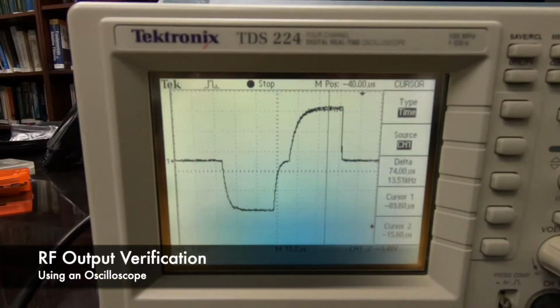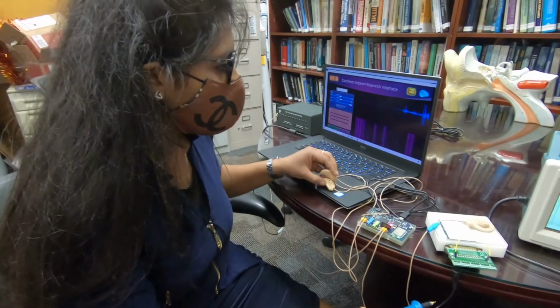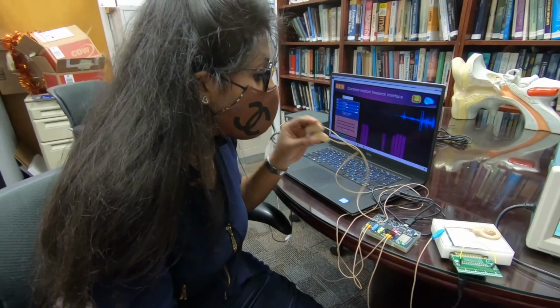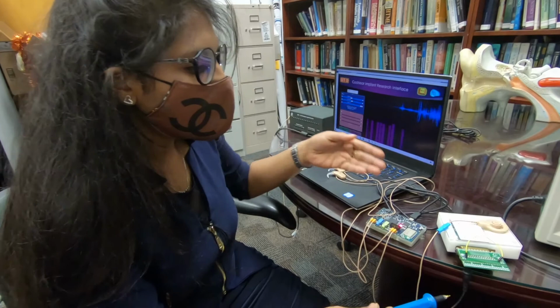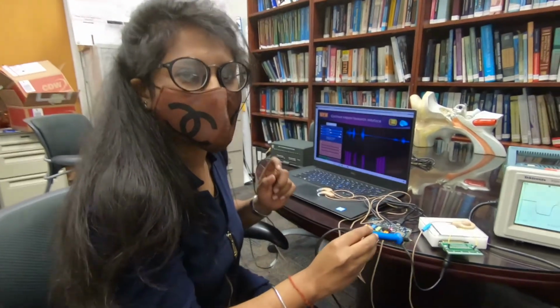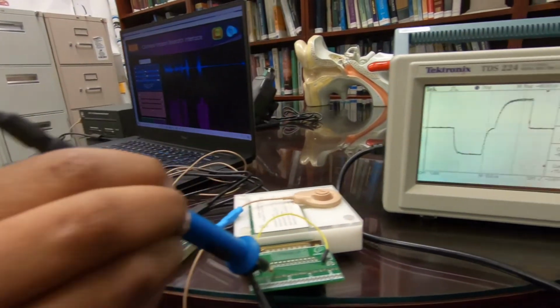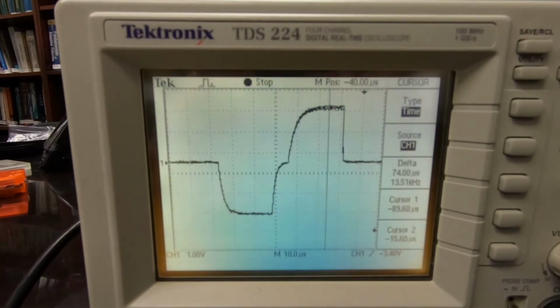Now, let's visualize what the output signal at the RF coil on the oscilloscope would look like. To capture the electrical stimulation, audio is recorded from the BTEs, processed through the PC, and generates a corresponding electrical stimulation that is sent back to the CCi-MOBILE. If we connect the RF coil to an implant emulator, you can probe the electrodes you want to see. Here, you can see trains of biphasic pulses being generated.